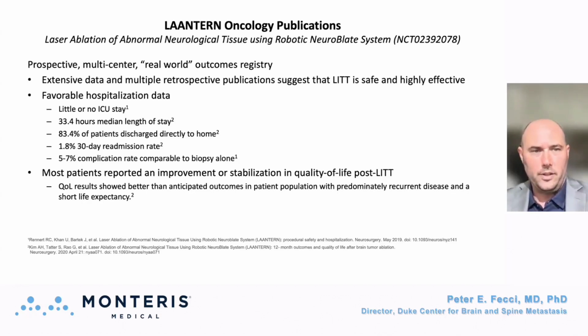Very safe, highly effective, little or no ICU stay. And again, keep in mind that this goes back to the very beginning of the procedure. Obviously, as people got more and more comfortable, people were getting pushed out of the hospital quicker and quicker, particularly during COVID. But even despite that, averaging it over the entire study, 33 hours median length of stay, over 80% of the patients going directly to home and not to something like a SNF or rehab, 1.8% 30-day readmission rate, and about a 5 to 7% complication rate, which is, of course, comparable to biopsy alone.